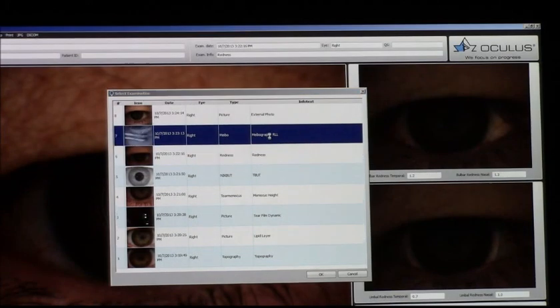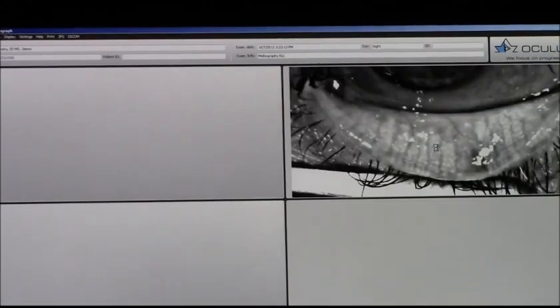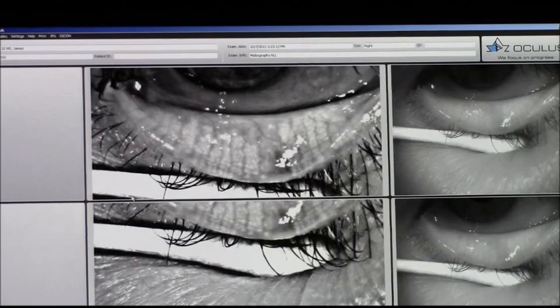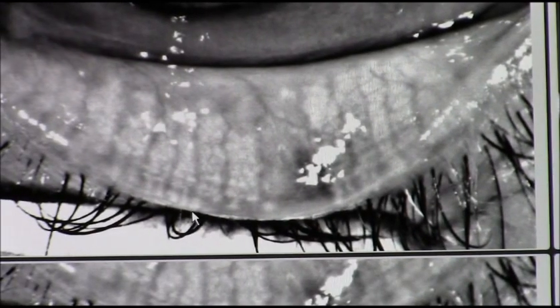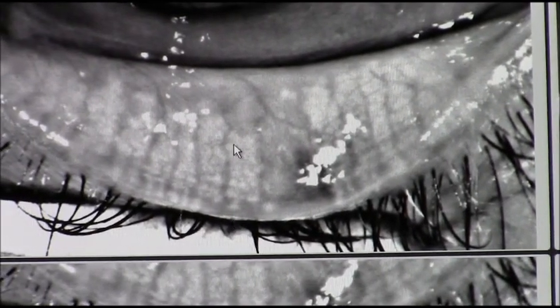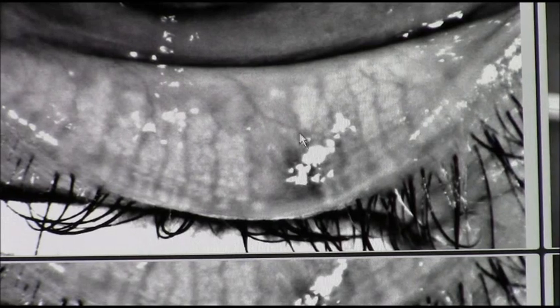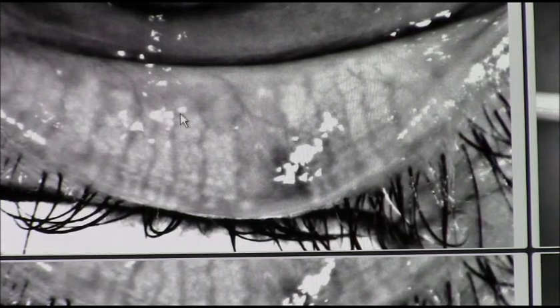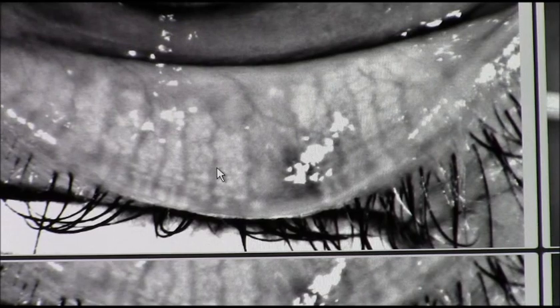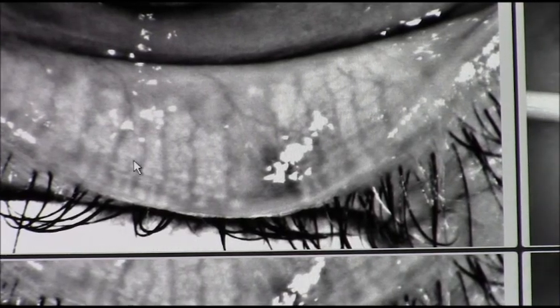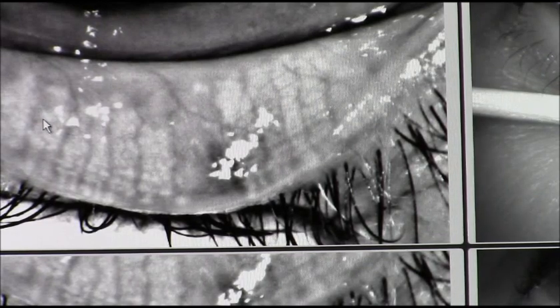The next test, which is really important, is that we can take a 3D image of the meibomian glands. You can see these glands here — they empty out through tiny openings on the edge of the lid and secrete the oil or lipid into your tear film. Some of these glands have died, and others are a little short. These glands over here are pretty normal. So this person has mild to moderate dry eyes due to the meibomian glands not secreting the proper amount of oil into the tear film, and we can photograph the quality of their glands.